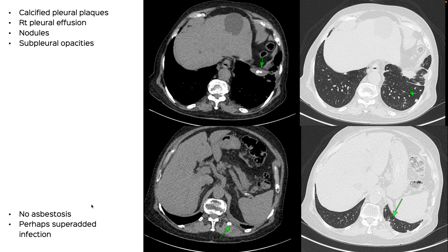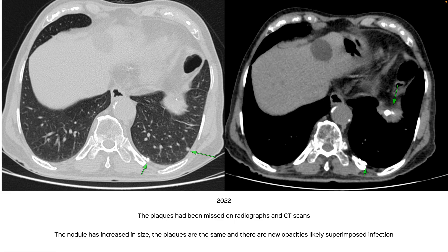Coming back to our patient: they have asbestos-related pleural plaques, nodules, sub-pleural opacities, but no asbestosis. The sub-pleural opacities are likely a superimposed infection. We found a CT from 2022 that the patient brought later — I added an addendum today. The plaques are unchanged, but the nodule has increased in size and the sub-pleural opacities are new, so we're still not certain whether the nodules are significant.